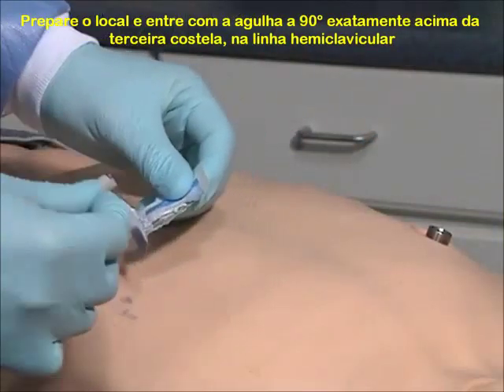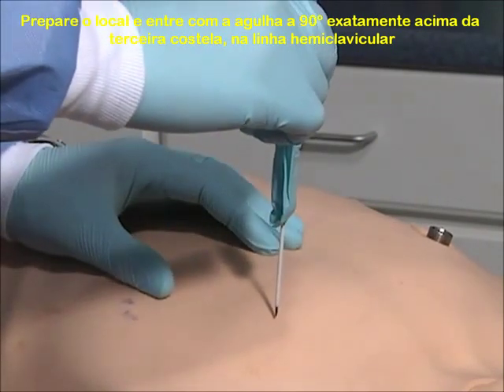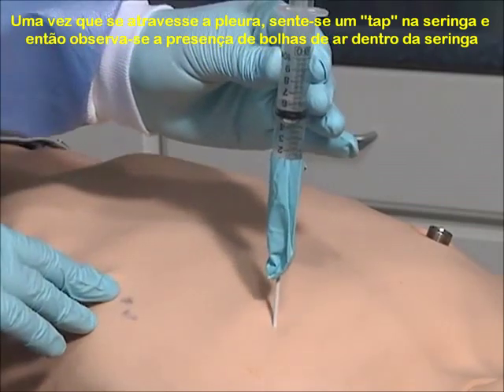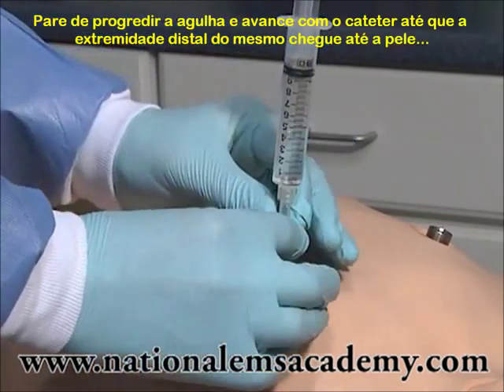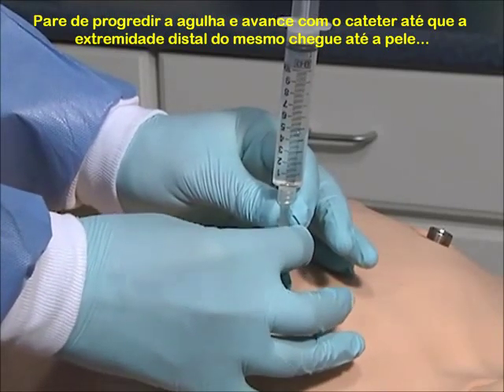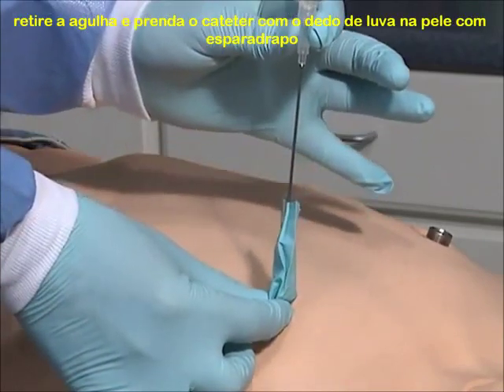Prep the site, then insert the catheter just above the third rib at a 90-degree angle. Once you reach the pleural space, you should hear a hiss as air escapes. Or, if you have attached a saline-filled syringe, you will see bubbles in the fluid. Stop advancing the needle and thread the catheter off until the hub reaches the skin. Remove the needle and secure the catheter with tape.